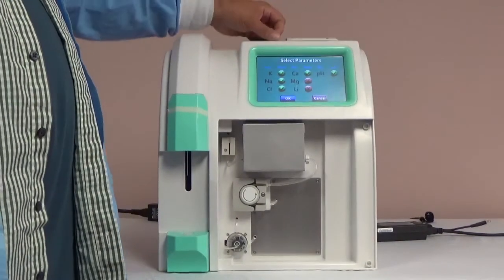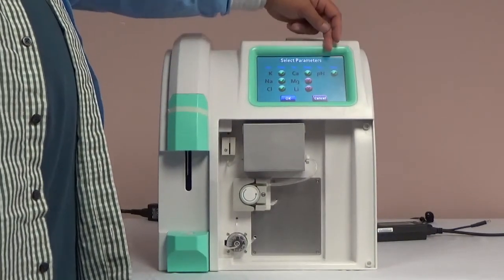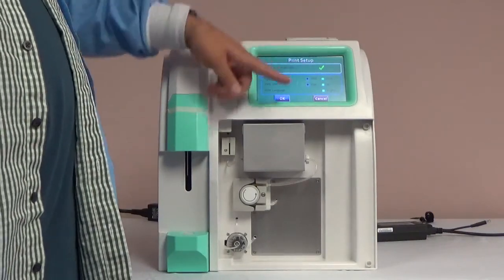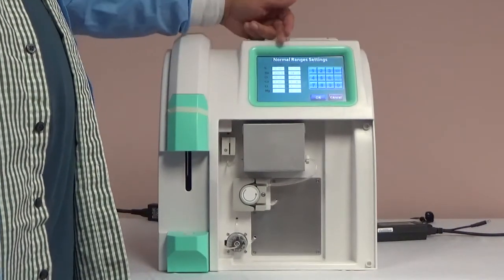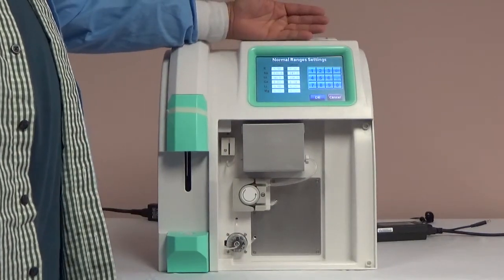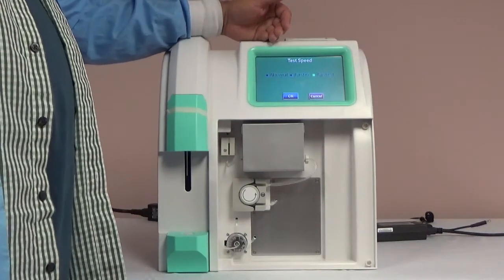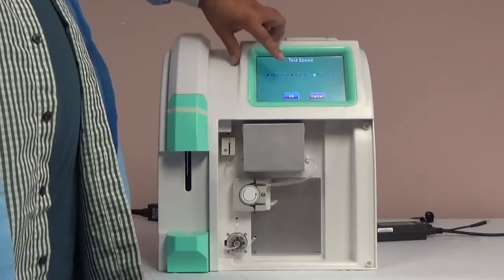Back on the system settings screen, the parameters option will show the selected parameters for the model analyzer you are using. You can use this menu to select the parameters you wish to test. All available electrodes are selected by default. The print setup turns on and off real-time prints. The rest of the options on the screen are default settings and should not be changed. The normal range settings should be adjusted by your lab once you have established your ranges. These ranges will print out on sample reports once you begin running samples. The test speed setting is how fast the analyzer calculates the result. This doesn't affect the amount of reagent used, but the speed it takes to calculate results. For best results in reproducibility, we recommend it is set at normal.